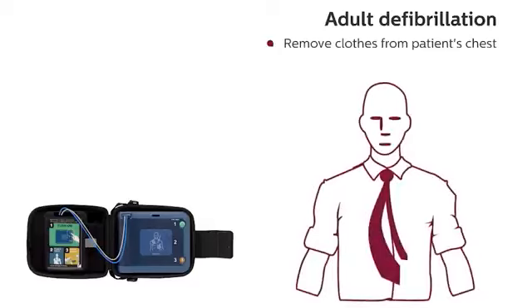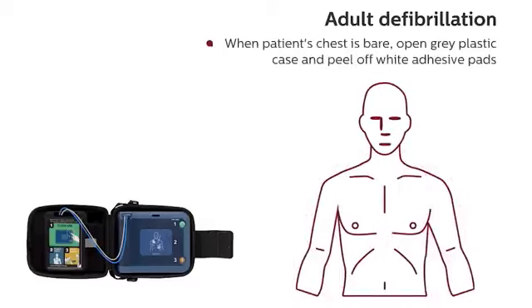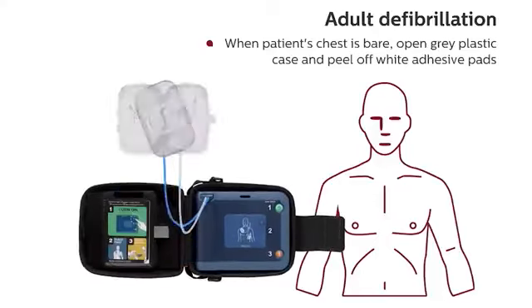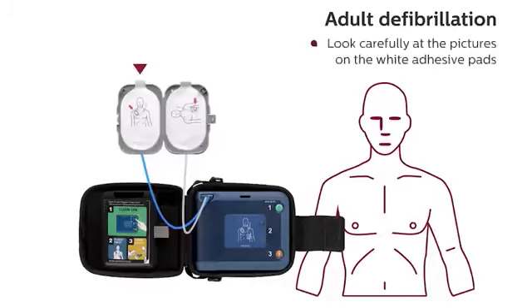Remove clothes from patient's chest. When patient's chest is bare, open the gray plastic case and peel off the white adhesive pads. Look carefully at the pictures on the white adhesive pads.